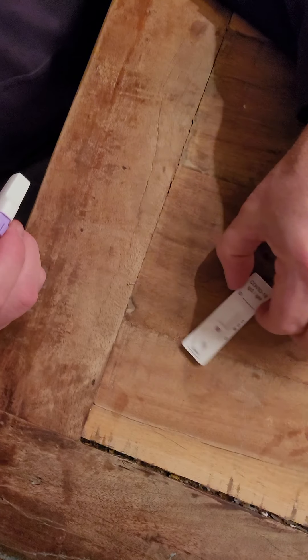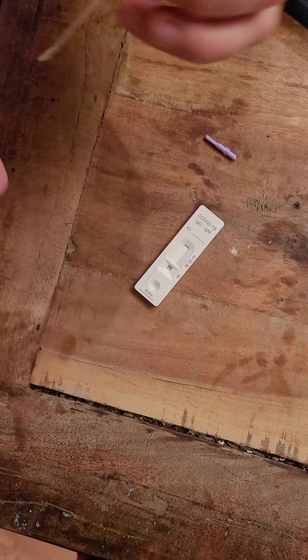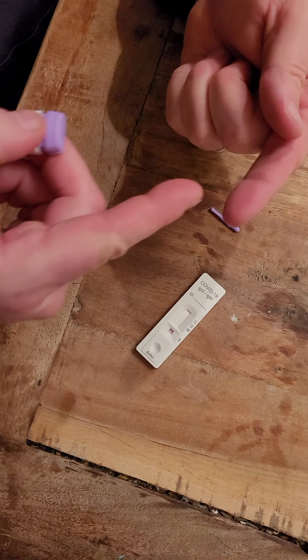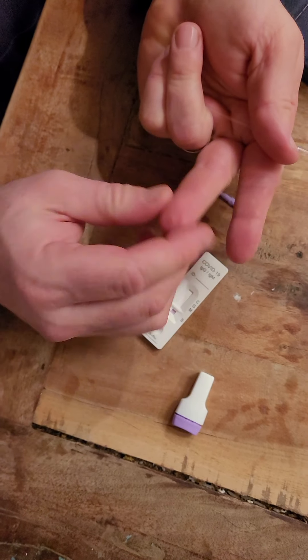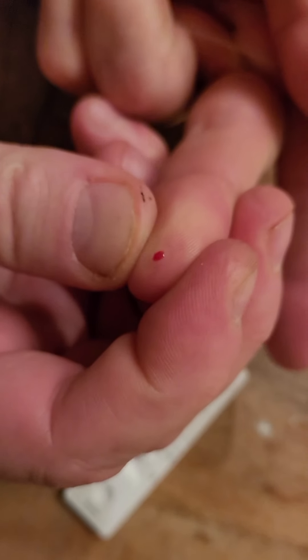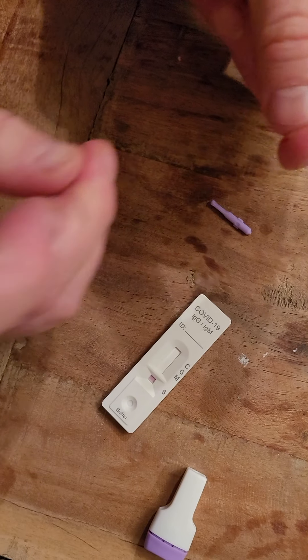Okay, here's the test. Take it out. Here's a pipette, take this. I forgot to give you these - you can use a pin, anything to make yourself bleed. You want to kind of push it out; it's almost easier if you use a pin, something that'll make you bleed a little bit more.